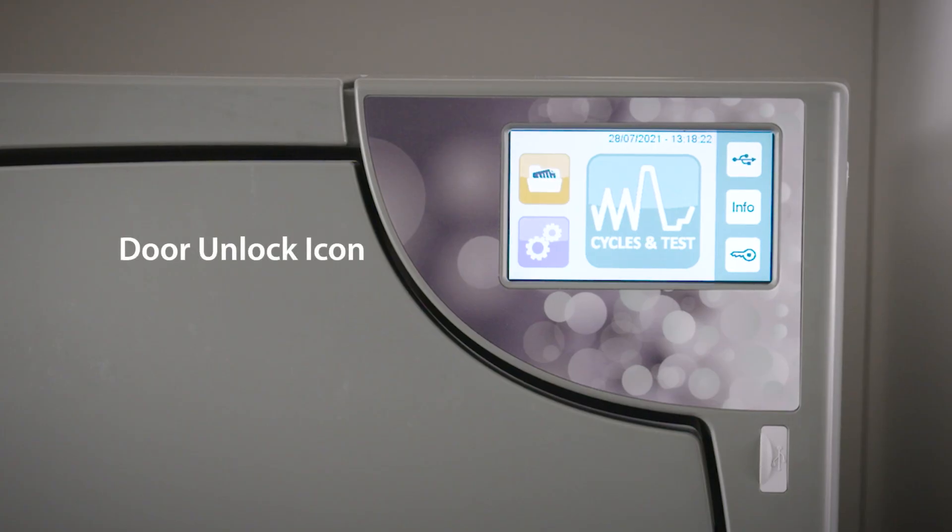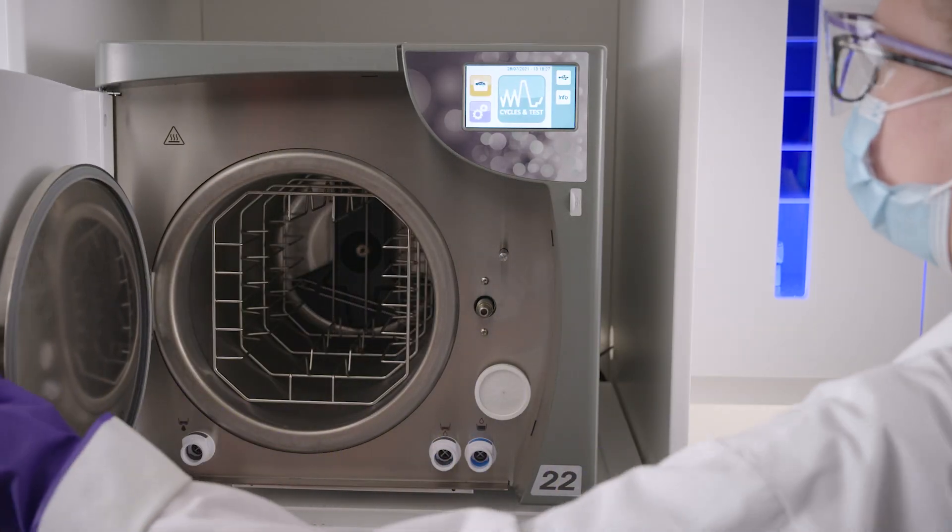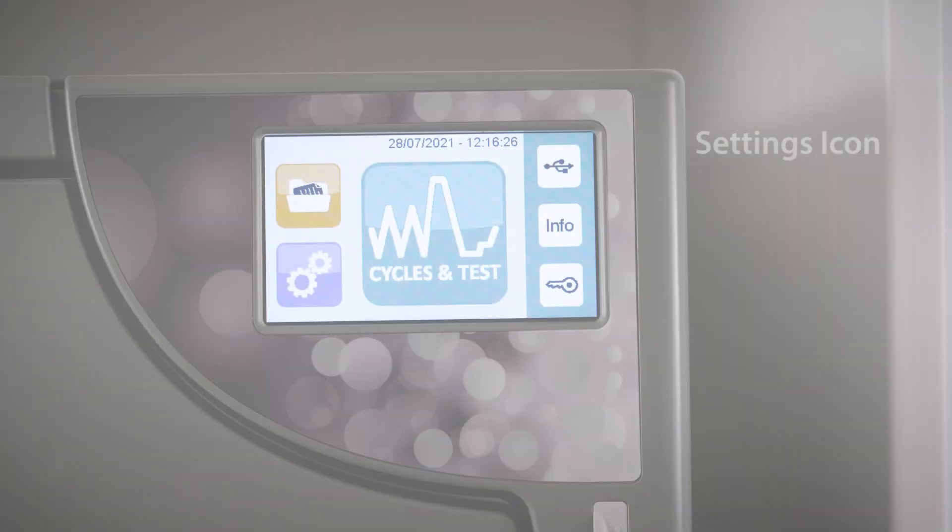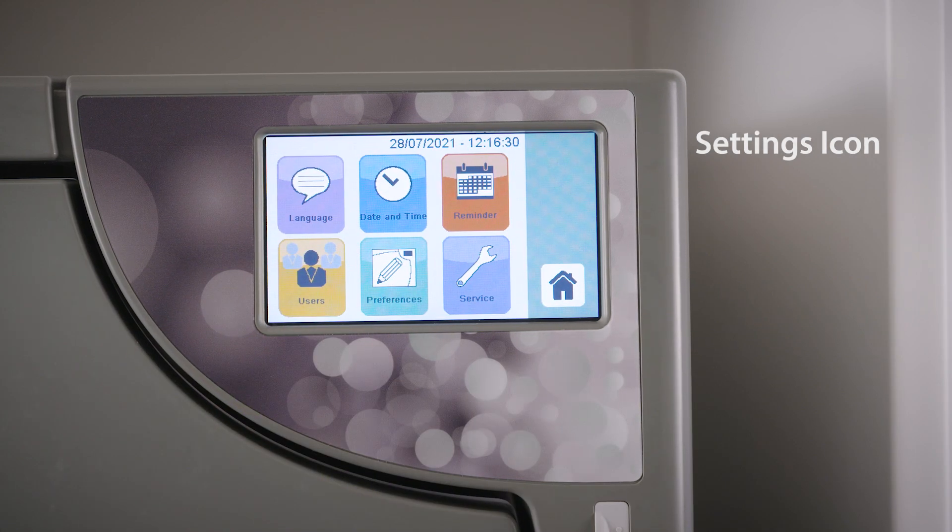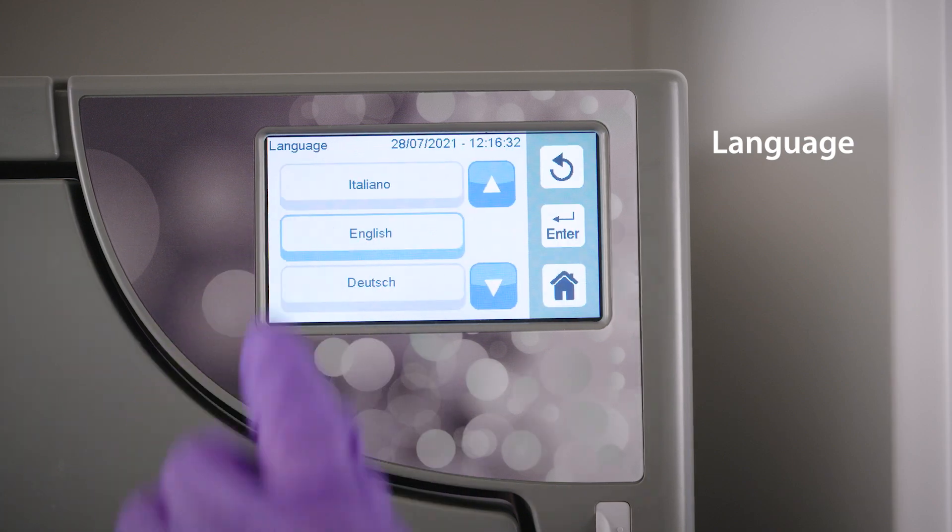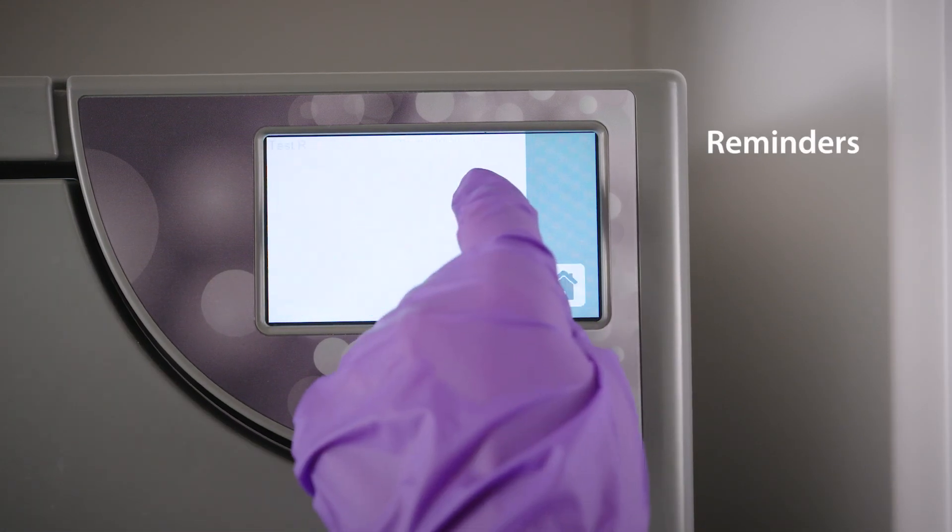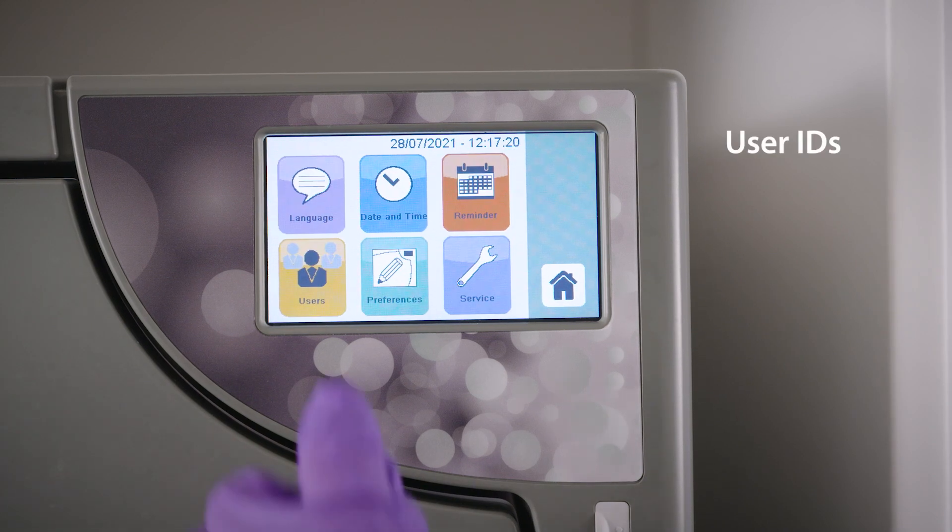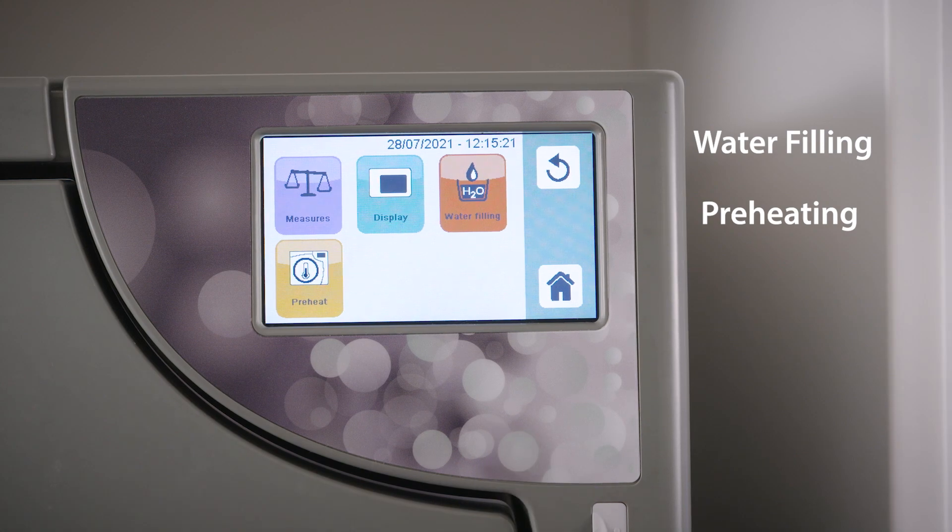The Door Unlock icon indicates if your door is locked or unlocked. Lastly, the Settings icon allows you to adjust the user settings. Features such as language, date and time, automatic reminders, user IDs, water filling settings, and preheating options are explained in detail in your operator's manual.